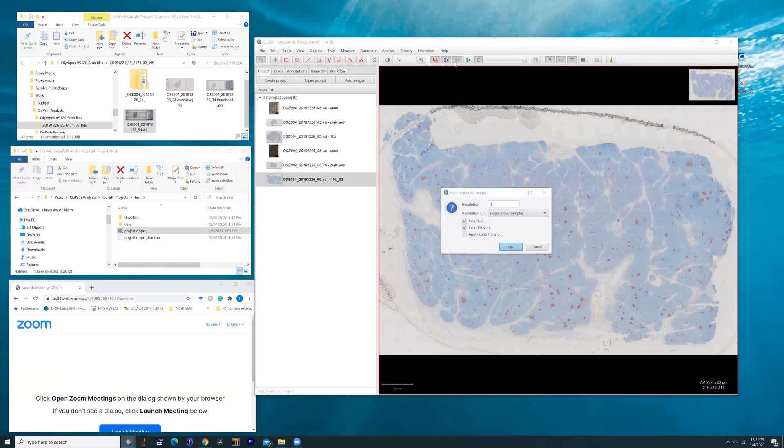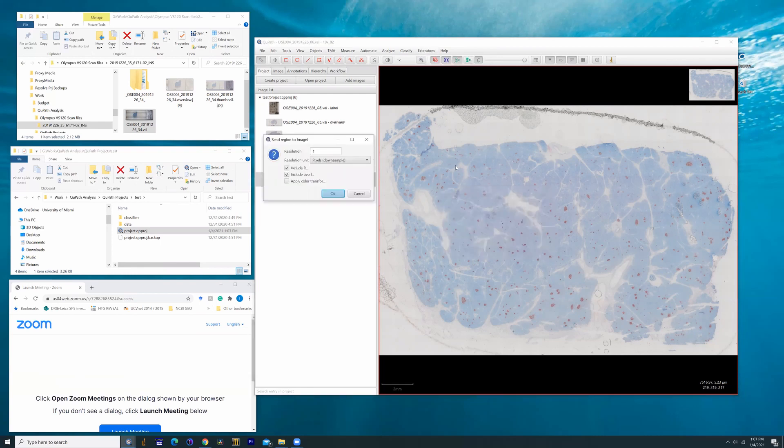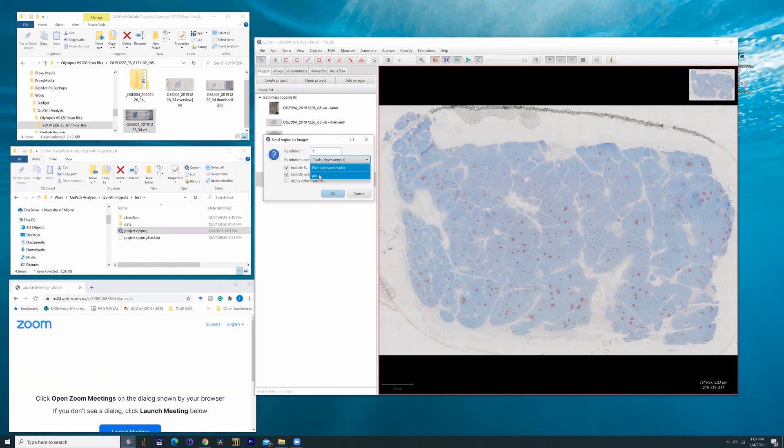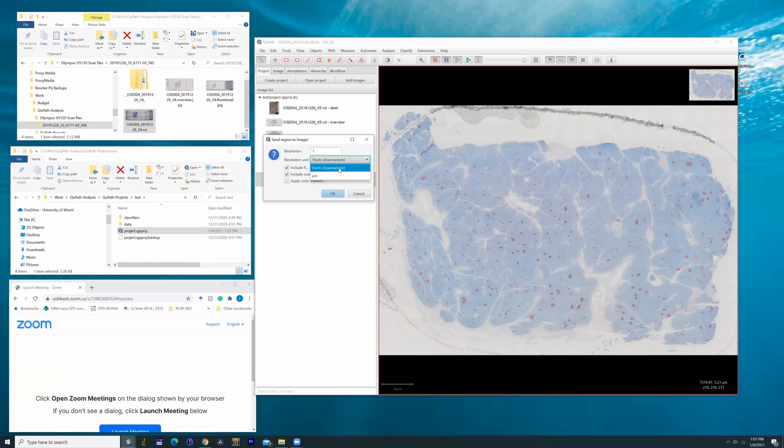If you reach into ImageJ, what will happen is you will see a pop-up occur. It will give us the choice of pixel down-sampling of micrometers. Basically, there's an underlying resolution to pixel count which will down-sample, or pixels are going to be fractions of micrometers. But in any case, it's going to down-sample the image.